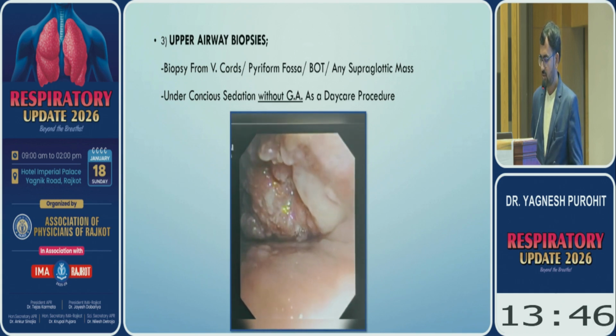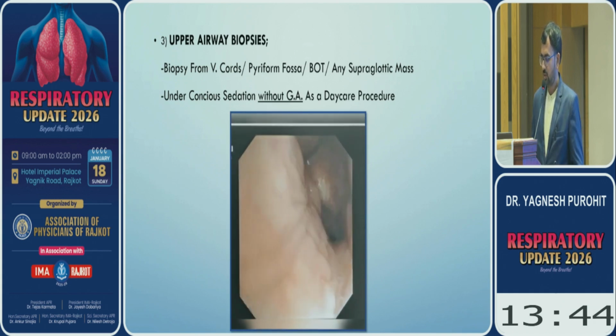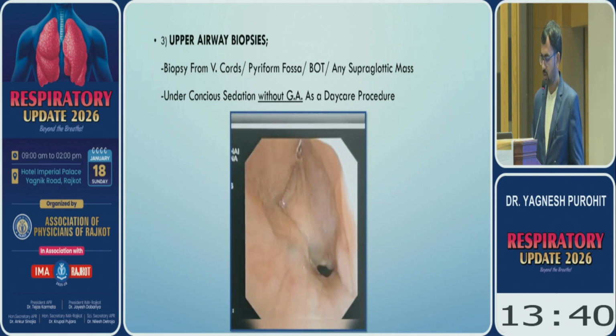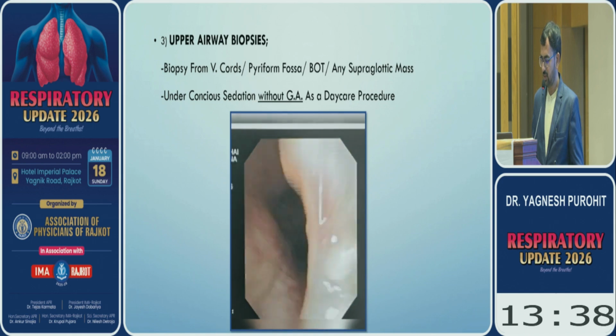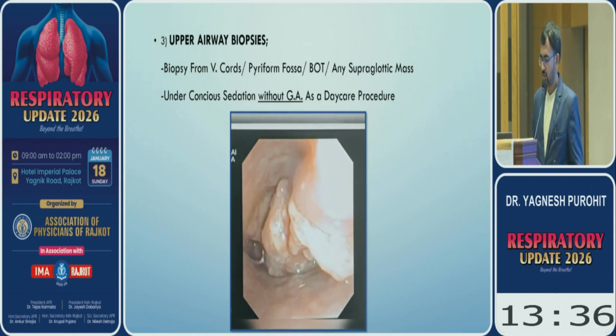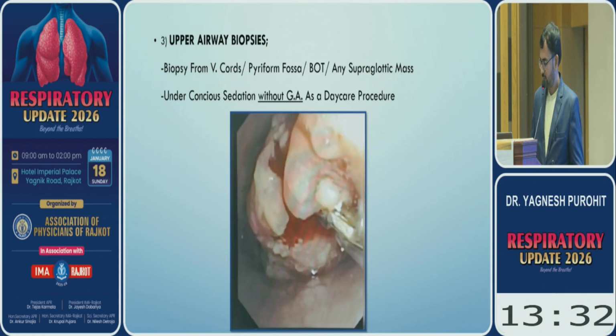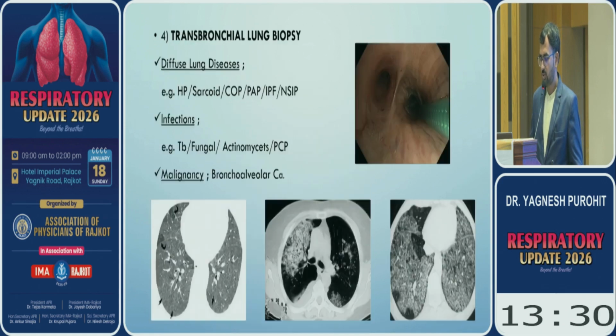So this is a video showing the growth in the supraglottic area involving the aryepiglottic fold. The vocal cord is not involved in this case, and a large growth is seen, and we can easily biopsy like this. So it is a very easy procedure.